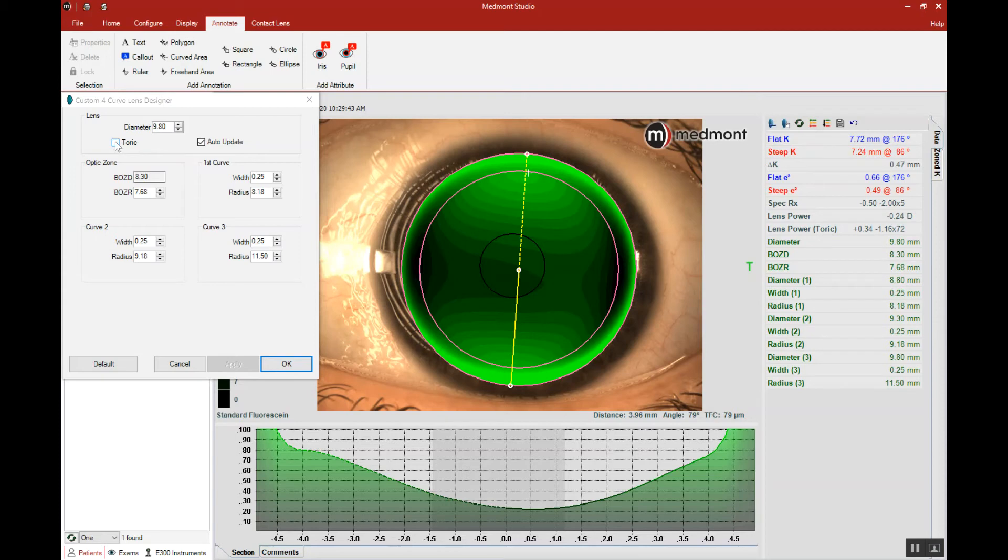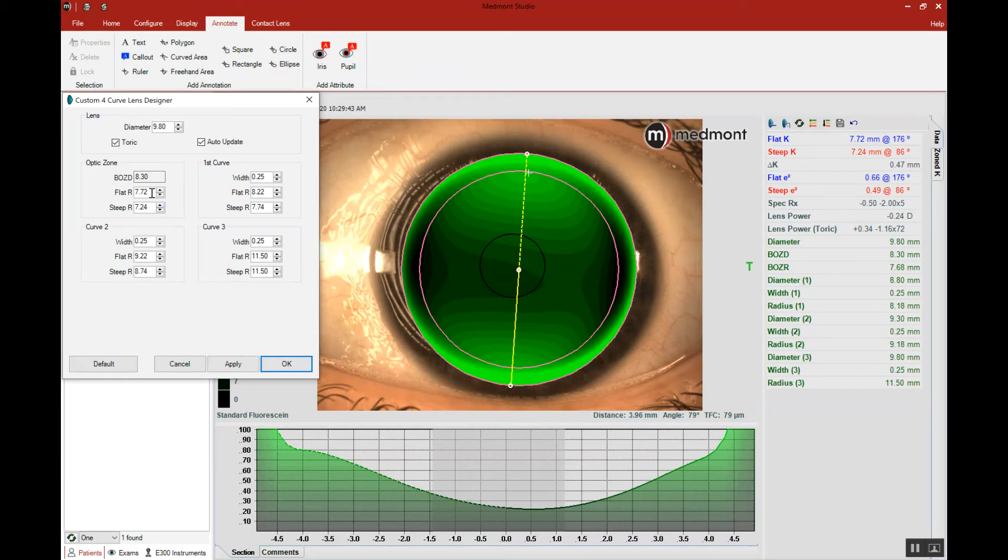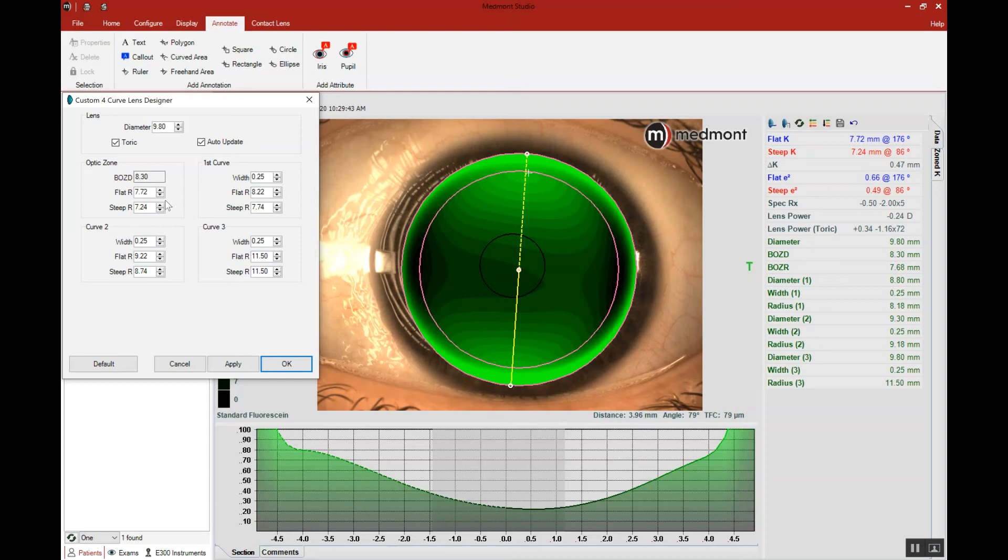Let's select toric, and now two base curves have been defaulted to: a flat and a steep. Notice that they match the k readings. So the Medmont software is automatically going to default to the radiuses of the flat and steep k.